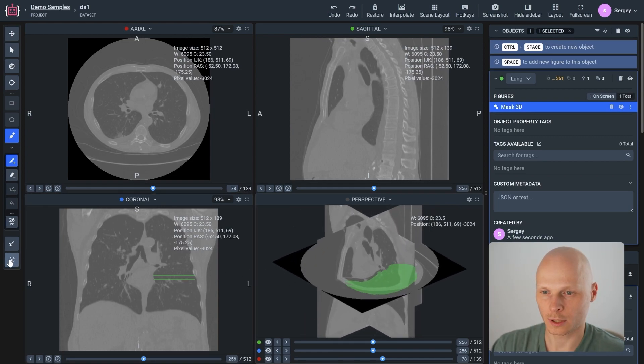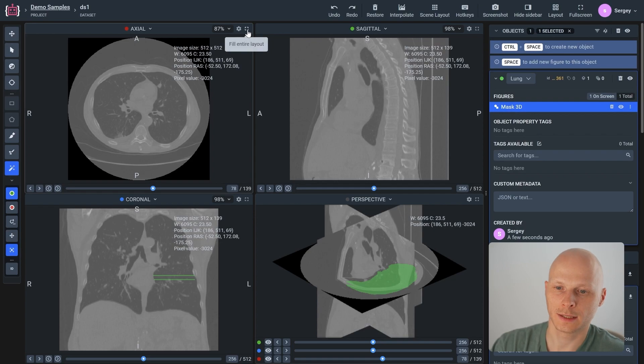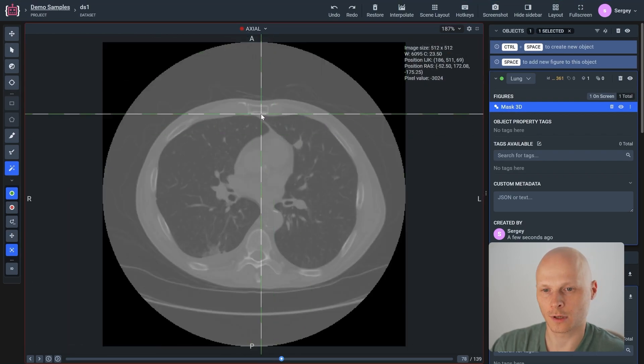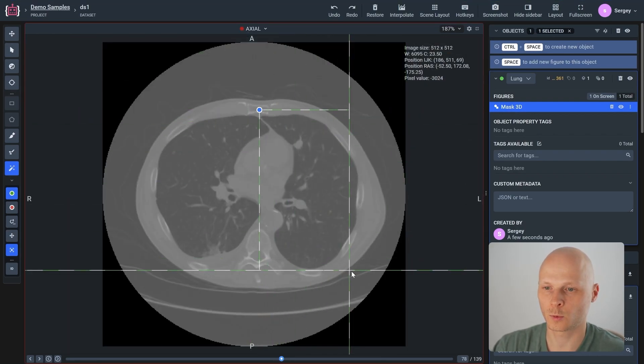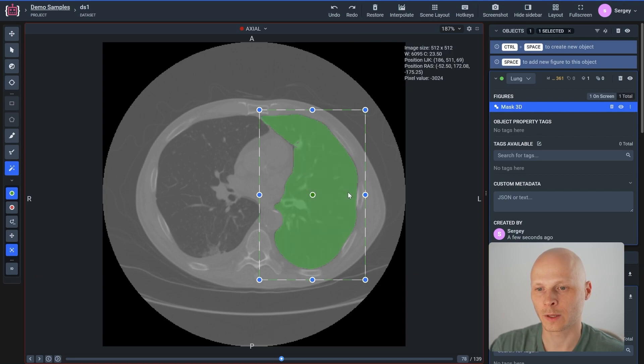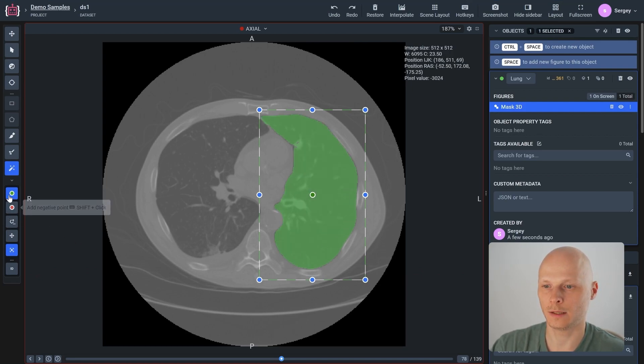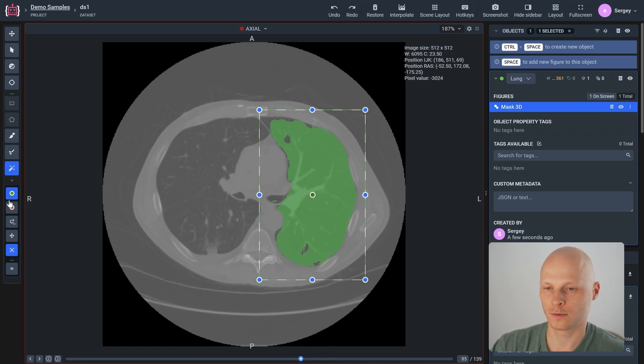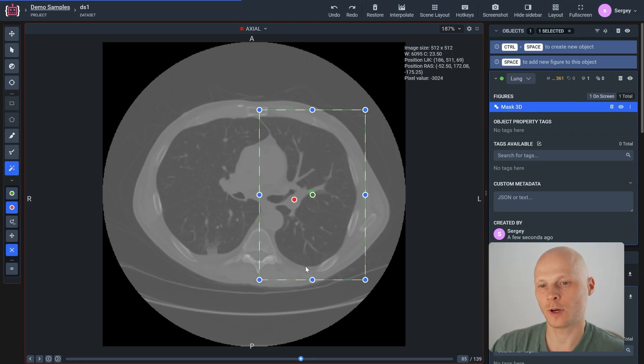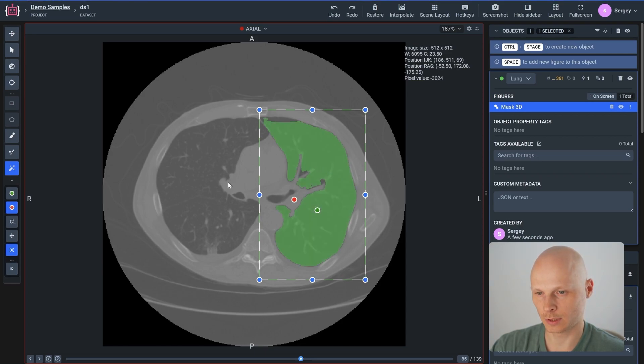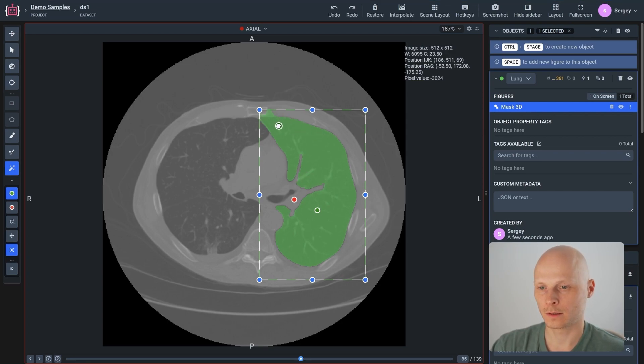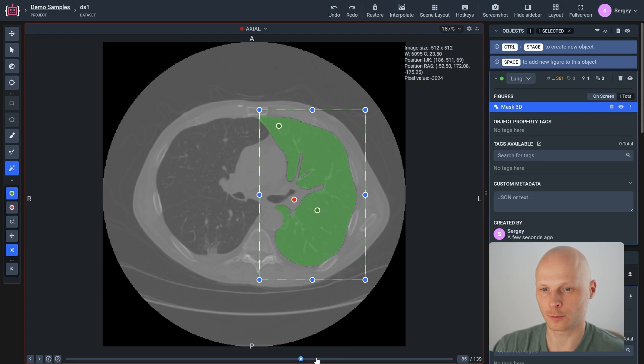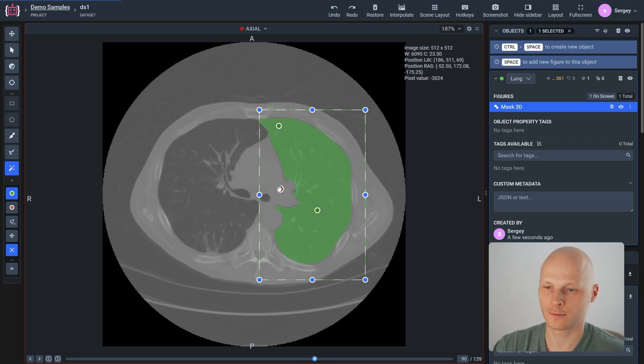We can use the smart tool to segment the object by placing a bounding box around it, and the neural network will predict the mask. We can communicate with the platform by providing red and green dots to correct its predictions. Once we are satisfied, we can press the space button, move to the next slice and repeat the procedure. The smart tool helps to segment the object faster than the default manual tools like the pen or the brush.